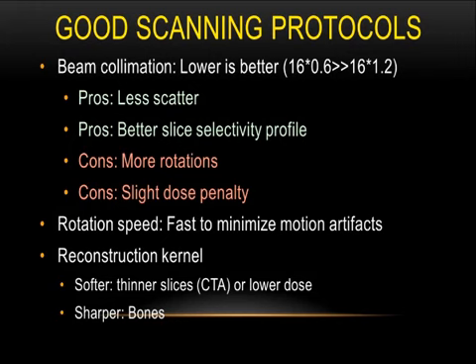And there is a dose penalty, as was shown in the morning by a very nice illustration where there was almost a doubling of dose when you went from a 4 slice to 64 slice, or something like that. That's because of the penumbra effect. Every time you scan a certain piece of anatomy, you are over beaming because the anatomy has to fit completely within the sweet spot of your X-ray beam.